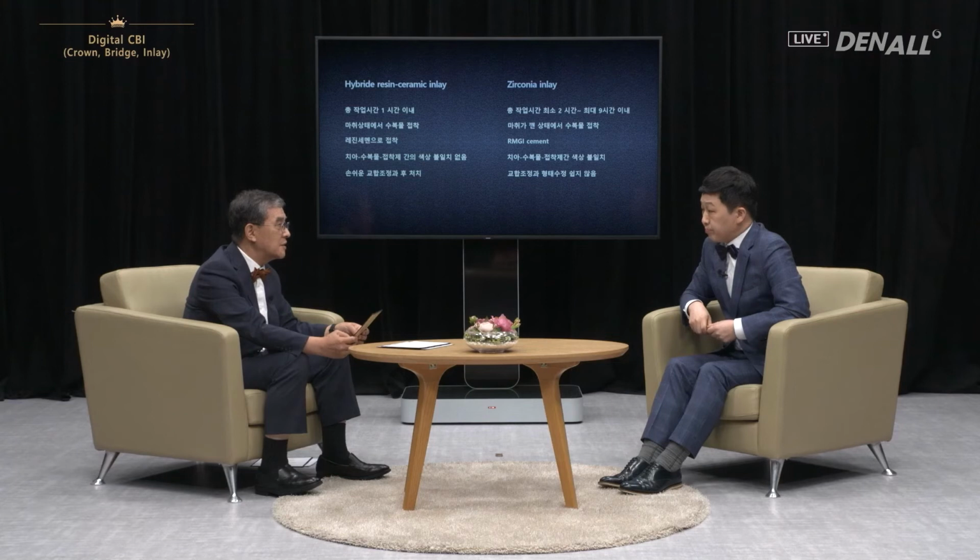When you do MO inlay or DO inlay, what do you think about the fracture issue? After I first started to use digital scanning, I did tons of cases, not just MO, DO and MOD. After a 1 or 2 year follow-up, there were a lot of cases where fracture occurred.